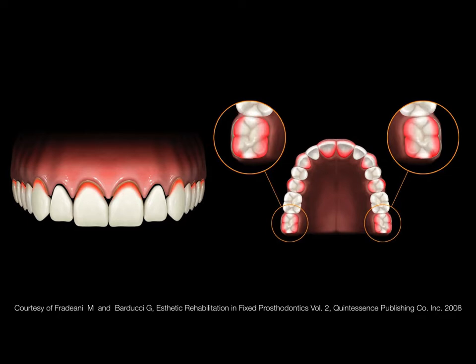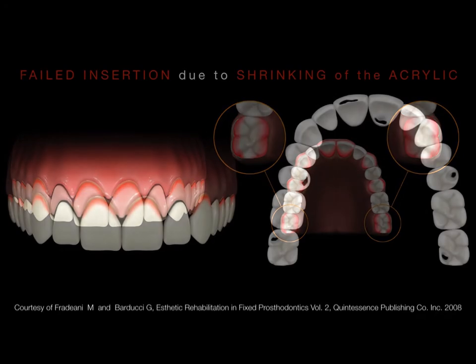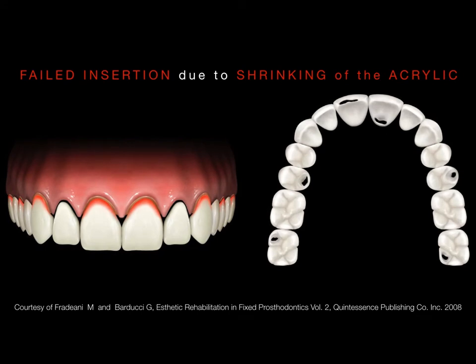So you can also appreciate that the tooth preparation in the posterior area sometimes seems to be outside the margin of the provisionals. And in order to have the chance to insert a provisional, the clinician is forced sometimes to re-prepare the teeth, to open the shell even more, creating some holes, and sometimes breaking the provisional completely. That is something that is really possible to see in many cases. So most of the time you vanify what you have obtained in the wax-up, which properly reproduces your treatment plan. Actually, it's not possible to replicate that on the provisional shell before relining.